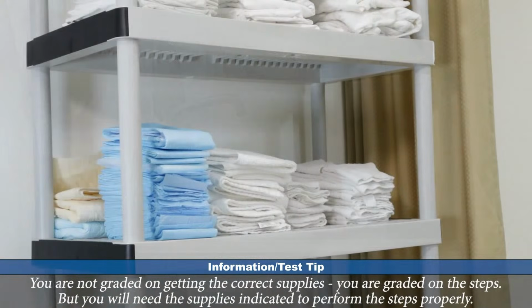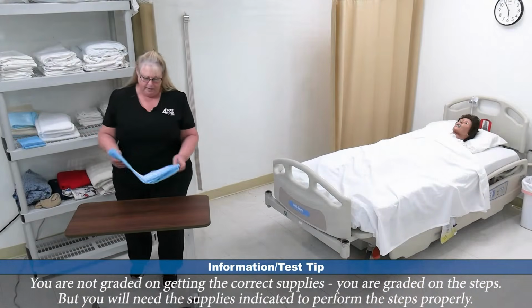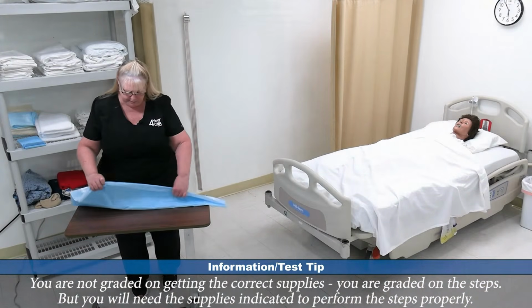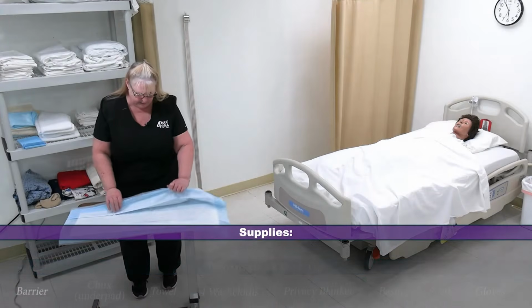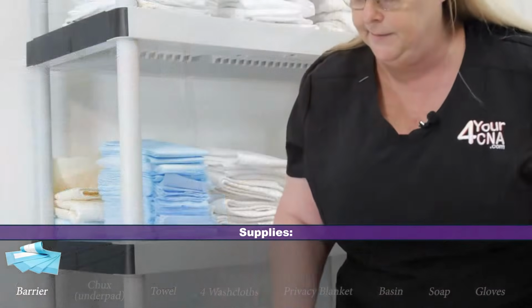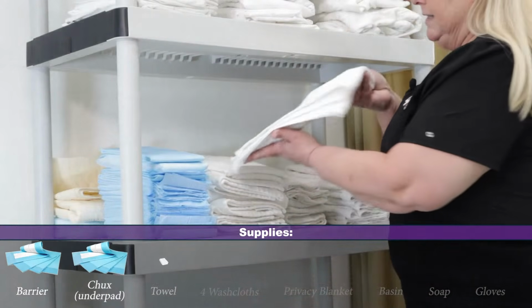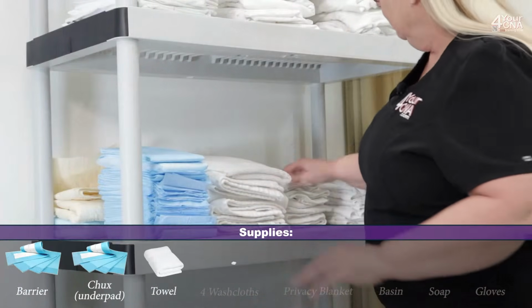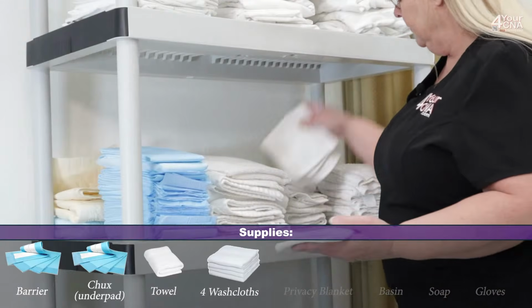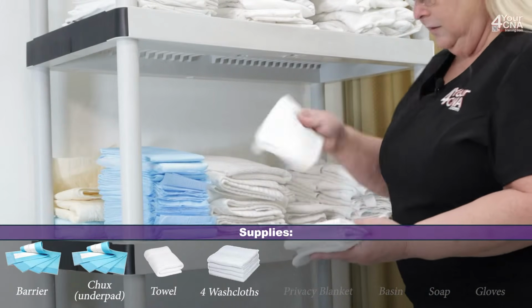Now that I have clean hands, I can get my clean supplies. We're going to place a barrier on the table with the absorbent side facing up. This gives us a clean area for our clean supplies. For this skill, we're going to need one underpad. We're going to need a towel, 4 washcloths, 1, 2, 3, 4.